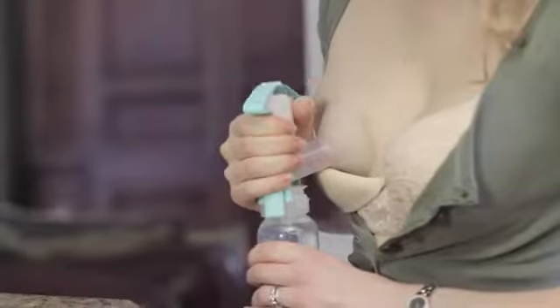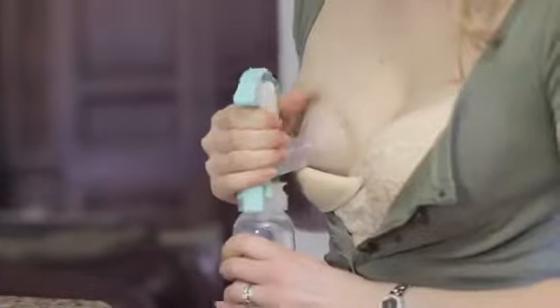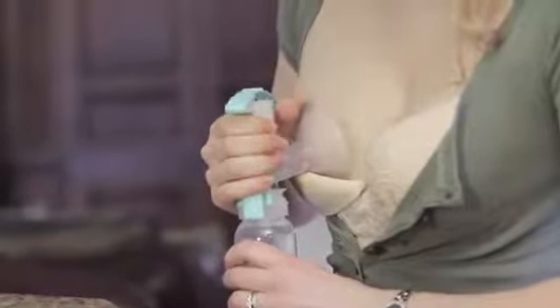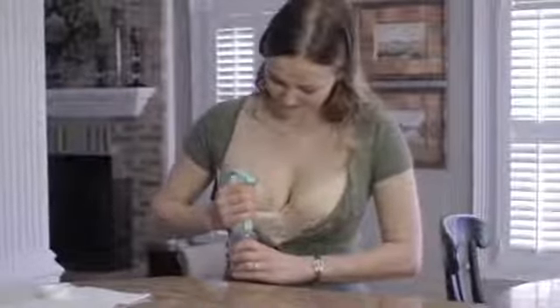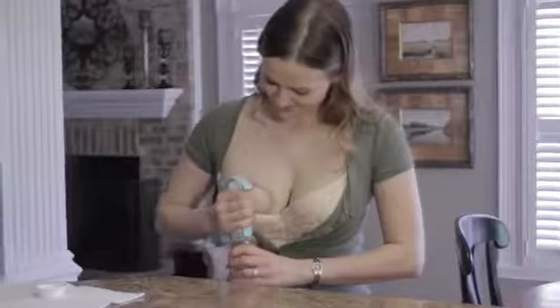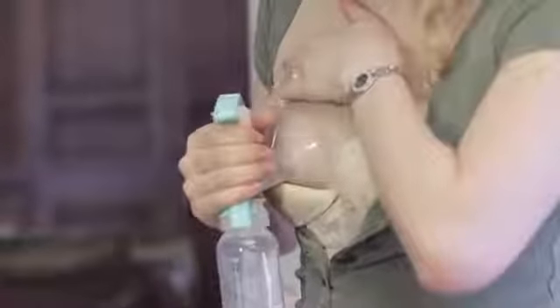Begin pumping with a few minutes of fast, gentle squeezes. This may help trigger the let-down reflex or milk release, just as your baby does at the start of a breastfeeding. You can also encourage milk release with a warm compress or by massaging your breast with your free hand, either before or during pumping.